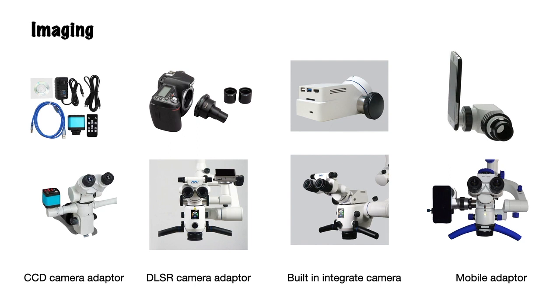This is a very nice choice for some people who want to use it. But the disadvantage of this tool is that it is heavy, and it takes space from the dental operating microscope. The other way is the mobile phone, for people who want direct access to social media, but it's not a good way, because here we have limited memory. It's not easy to delete and format your storage every time. This one is good, but it also takes space, so it's not slim.